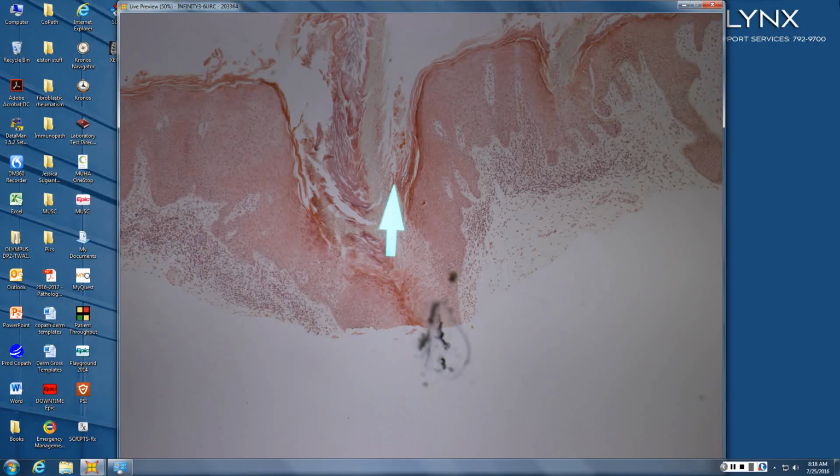At first I was thinking Dowling-Degos, but I thought some type of porokeratosis. Porokeratosis that has a psoriasiform plaque, like an acanthoma on someone's backside, with multiple cornoid lamellae.